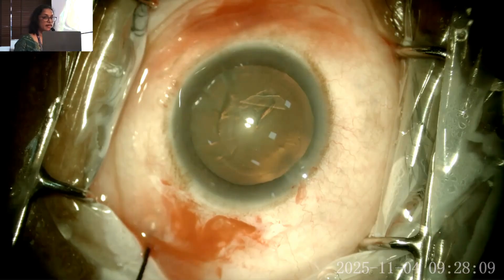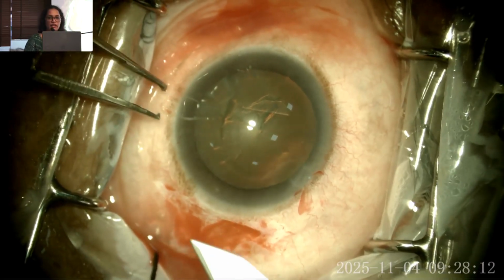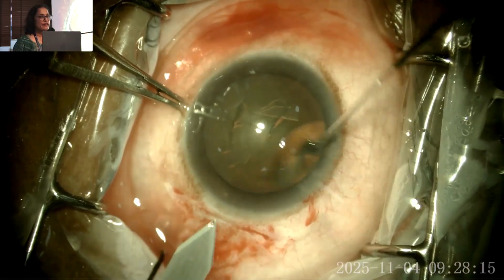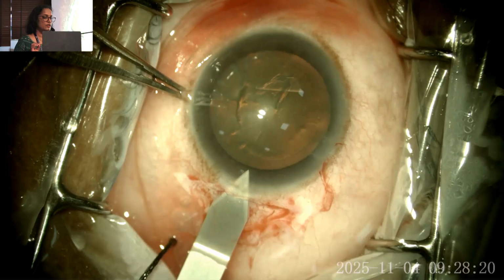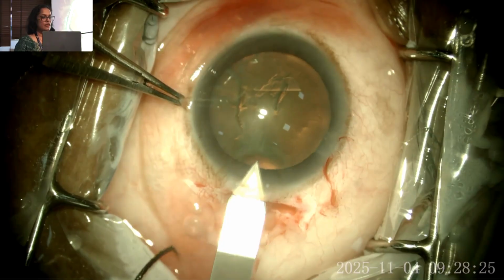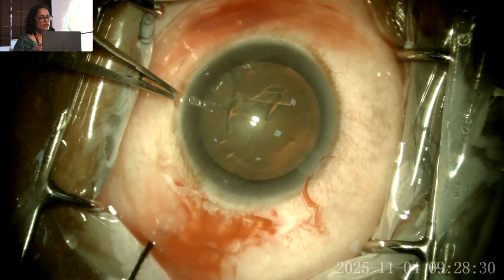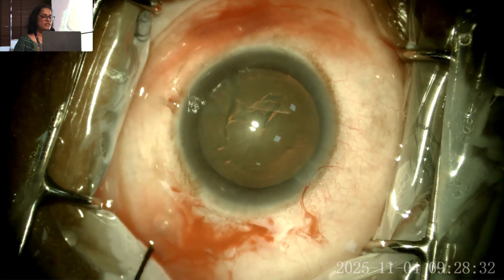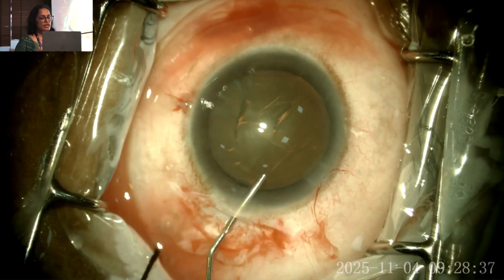And the next very important step is hydrodissection. Hydrodissection should be cortical cleaving hydrodissection, and we have to rotate the nucleus. The nucleus should rotate very freely in the bag. Hydrodissection we always do through the main port: burp out a little bit of visco by dipping the posterior lip of the incision, then go lift up the rhexis margin and inject the fluid. That's how you ideally do the hydrodissection.